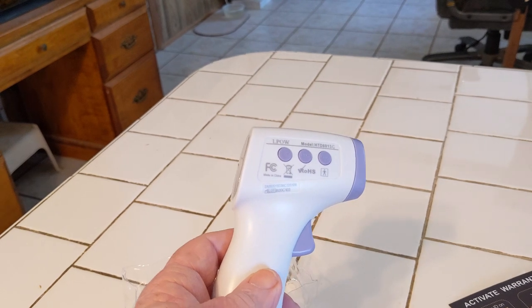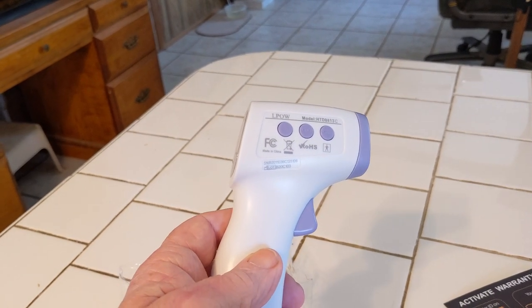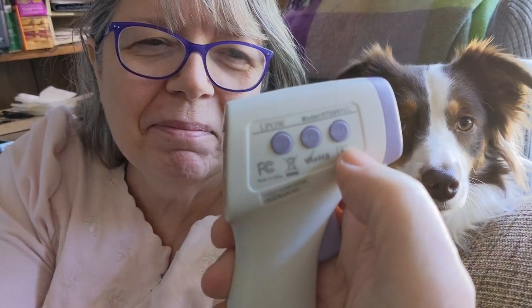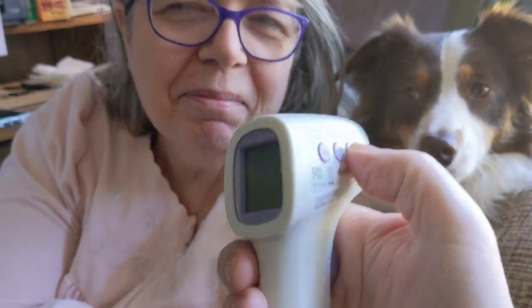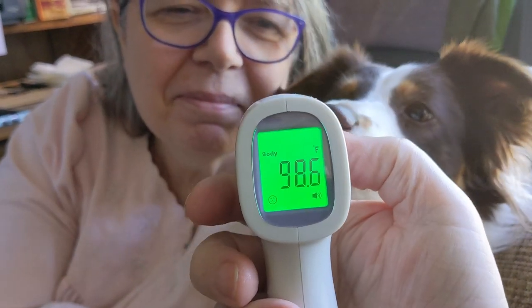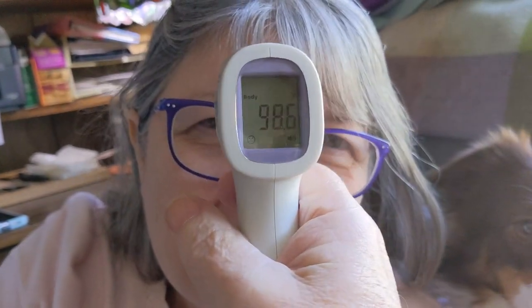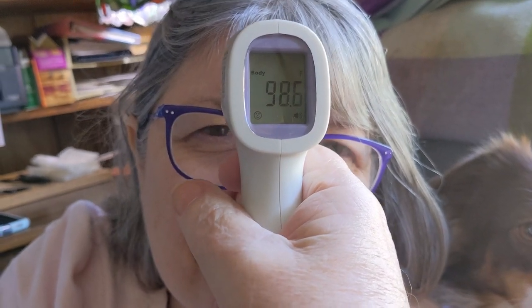I think maybe we can take Sue's temperature — see what it's at. All right, hey Sue, do you want your temperature taken? How about you, Lacey — do you want yours taken? All right. In order to turn this on, all you have to do is press the first button at the top where my thumb is. Hit that, and you can see it came on and it says body. To take the temperature, you get about an inch away and then you just squeeze the trigger.